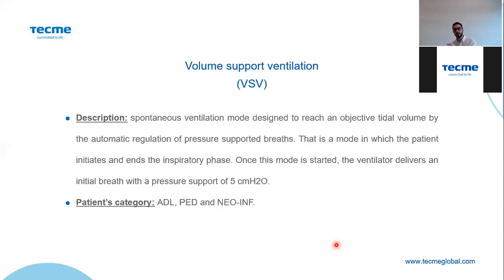100% spontaneous mode, okay? So if I'm telling you it's a 100% spontaneous mode, I am telling you that here you are not setting an inspiratory time and you are not setting a frequency, okay? So you can say with this information that you're setting here an expiratory sensitivity.